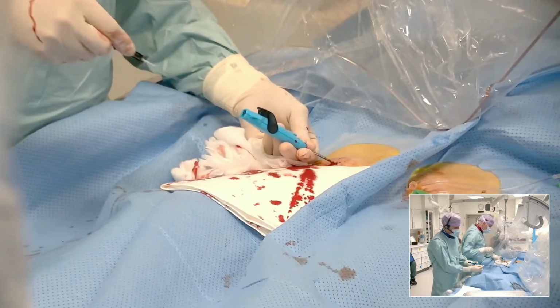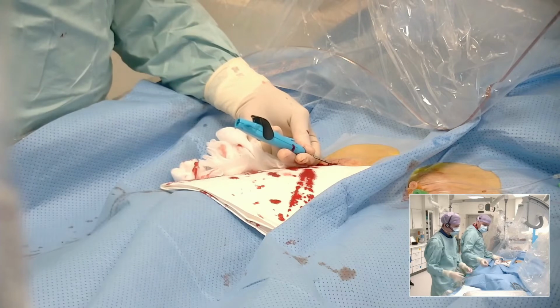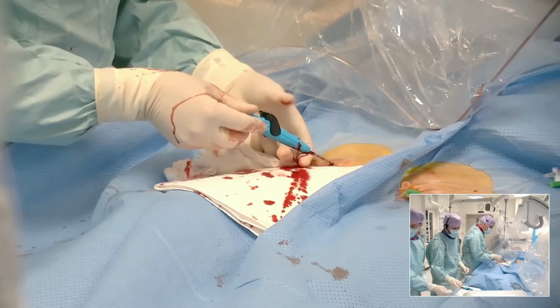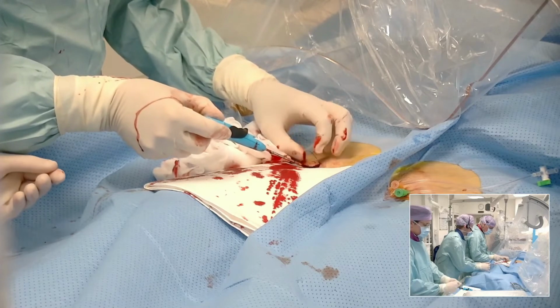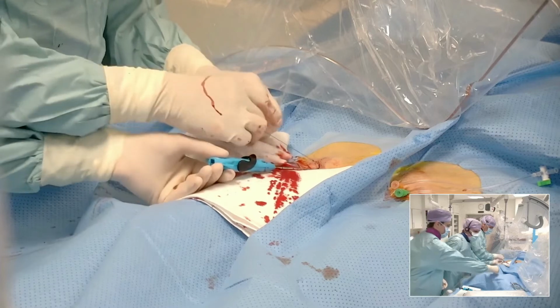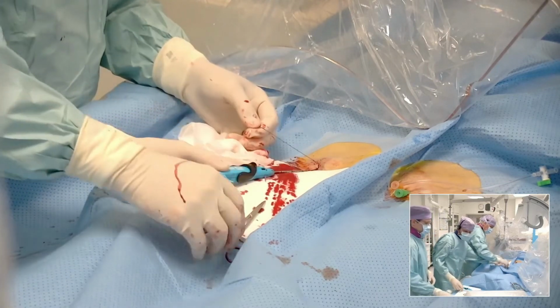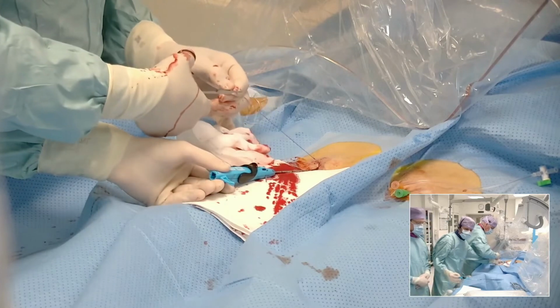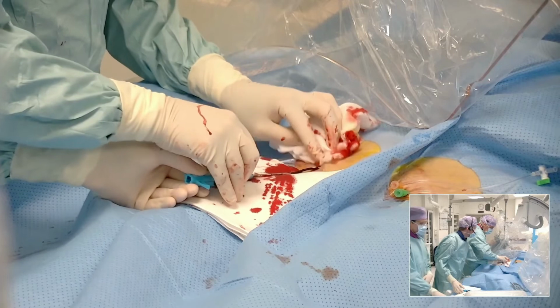First of all, there's an extra measurement tool on this shaft, which gives you an idea of the skin to artery distance, and this is also handy afterwards if you have to do the pushing on the knot. The forceps. Yeah, the forceps. Secondly, the needles have been reinforced, so they deviate less easily on a little bit of calcium.